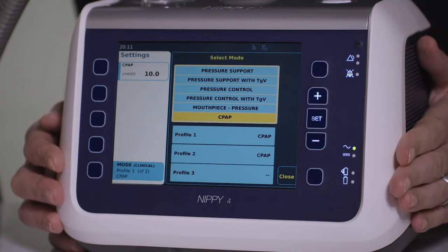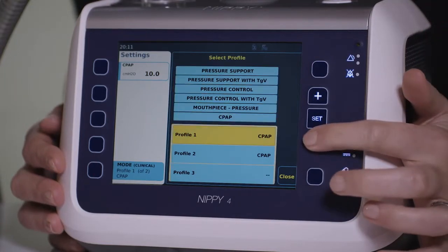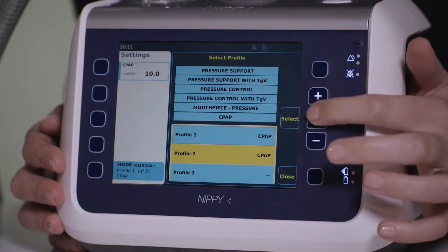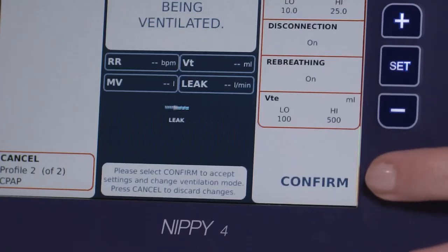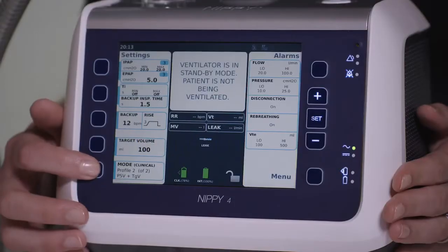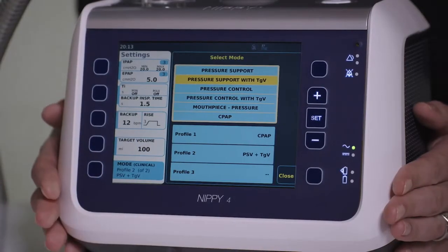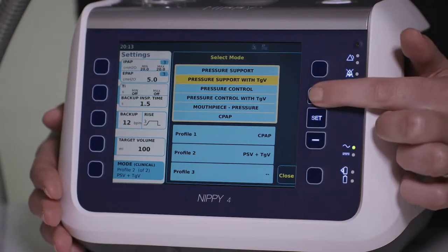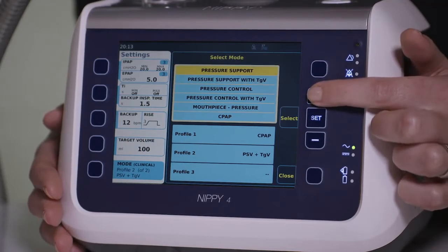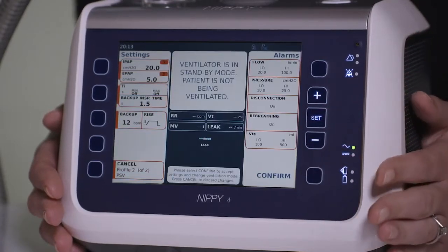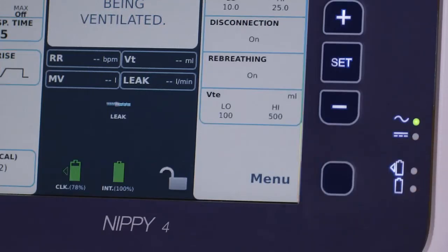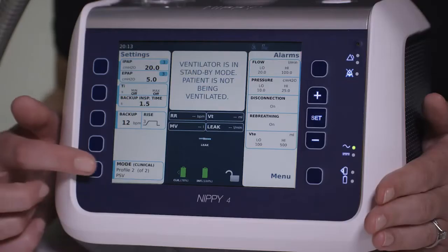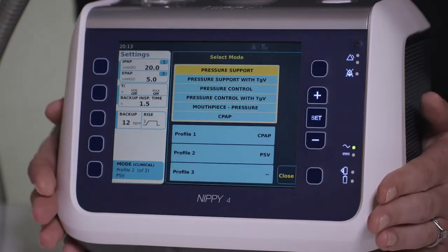The NIPI-4 and NIPI-4 Plus allow you to select up to three patient profiles to set up. First, select the profile you wish to use, then select the mode you wish to assign to that profile. When making a major change to a mode or patient profile, the user is asked to confirm the change via the bottom right button.